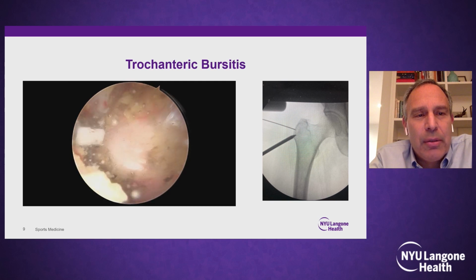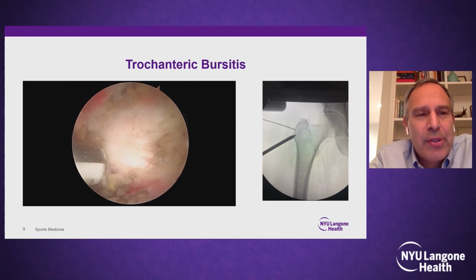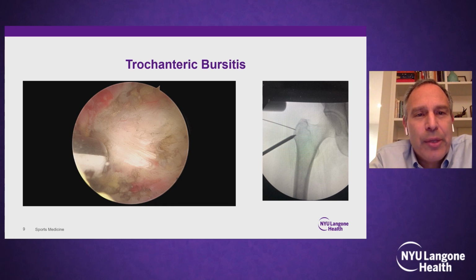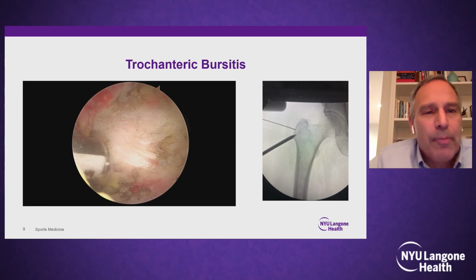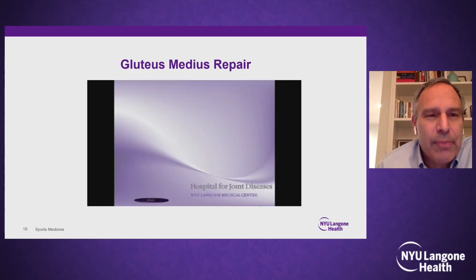I'm just finding it becomes pretty amazing how there's very little acreage or space there to be working with, that the proximal portion of that greater trochanter quickly becomes near the vastus lateralis ridge. It's very small, but you do want to stay midline. You don't want to get too posterior where you might find your sciatic nerve, or too anterior. So I would advise you to keep your patella facing the ceiling so you can get your version basically correct.